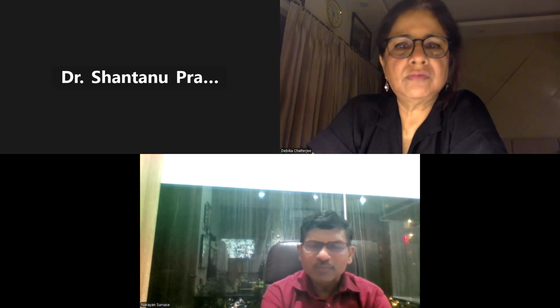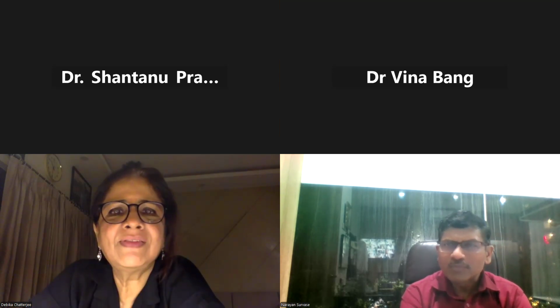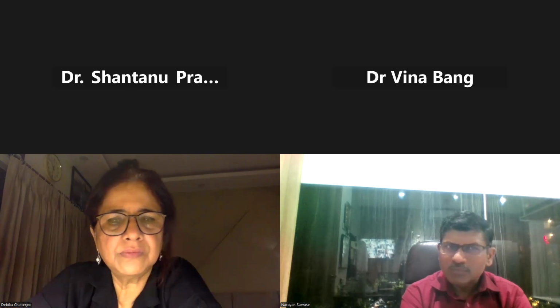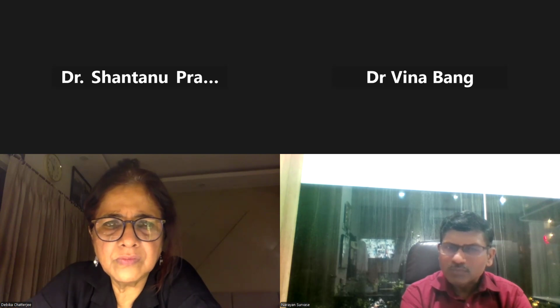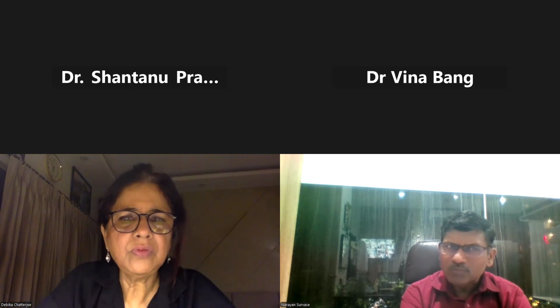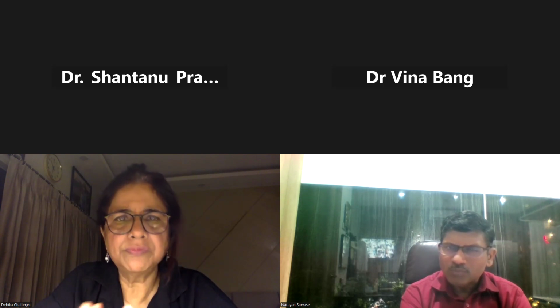Good evening, ma'am. Thanks for the wonderful and elaborate talk on diastolic dysfunction. My question was just to simplify the talk, ma'am. When we are by the machine and leaving aside other parameters because they are straightforward, when it comes to putting across the pulse wave Doppler across the mitral valve, when we have the graph of the E wave and the A wave in front of us, practically what should be the approach when we look at the E wave and A wave to start with? And from there, when should we go towards the TDI? Practically, what do you usually follow in the course of steps by the machine? If you can just help us with that particular flow of working, that'll be great, ma'am.